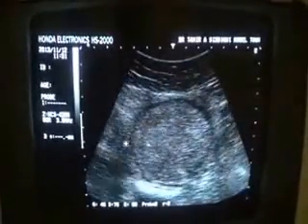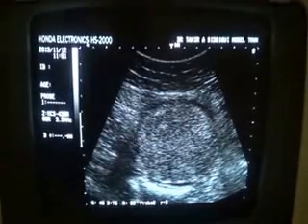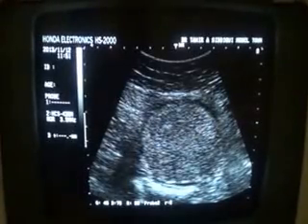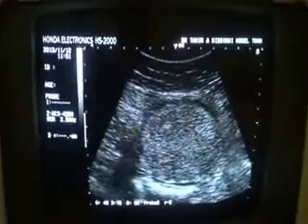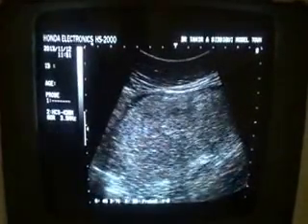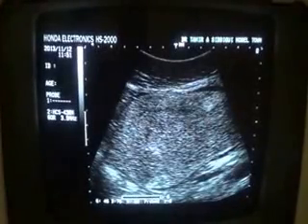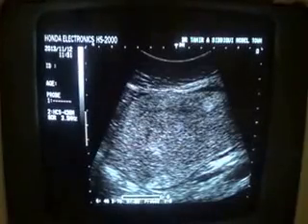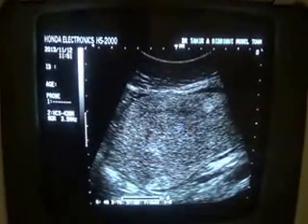So I will suffice with the findings, and if you note one more finding, that is that this echogenic area is surrounded by a thin fluid rim. So this will require surgical intervention, and its exact nature will be defined by biopsy. And this solid echogenic area gives no mass effect.